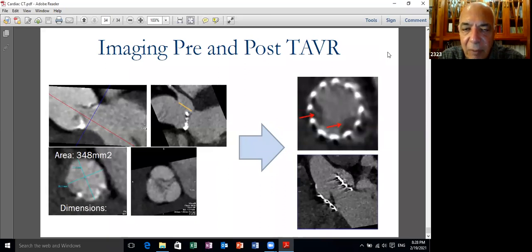And I think with the new machines, you can get all the information from one cardiac cycle. So if you have a dual source 320 detector, with the capability of getting everything in one cycle, then under these circumstances, you can do it in atrial fibrillation. Atrial fibrillation is not a contraindication, but it can produce a suboptimal picture unless you take care. Sometimes you can pace the ventricle.